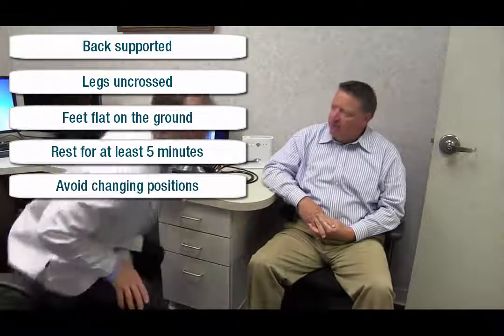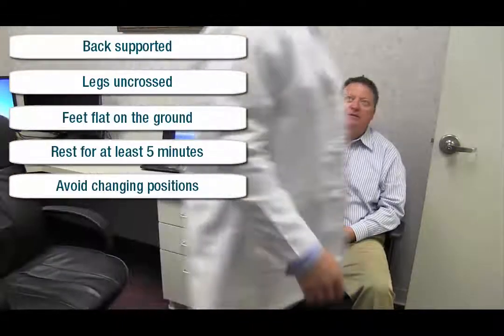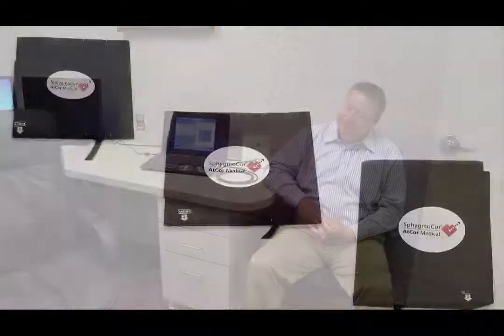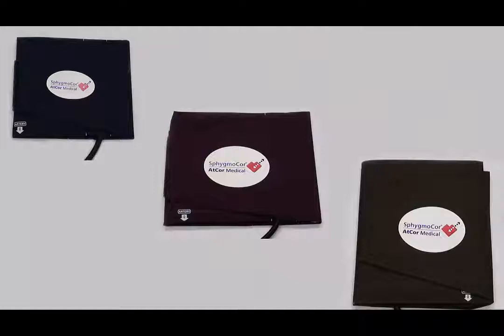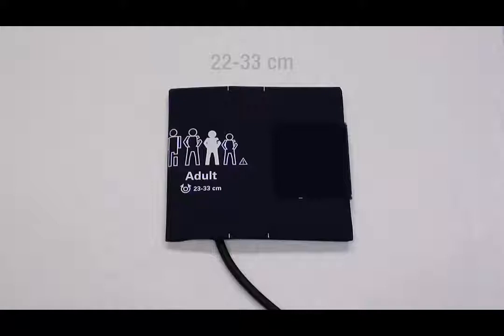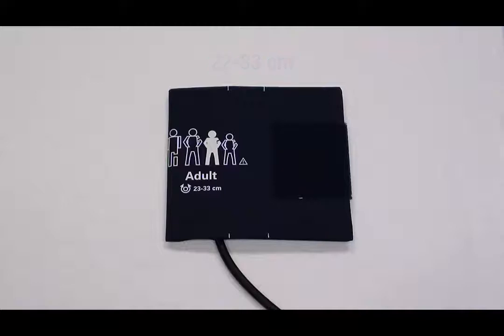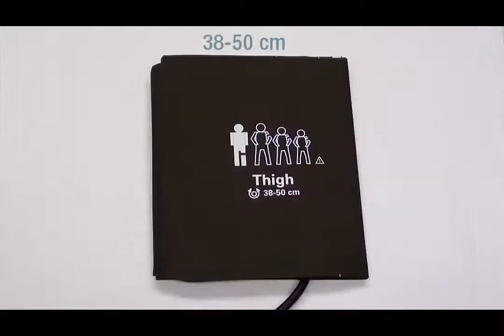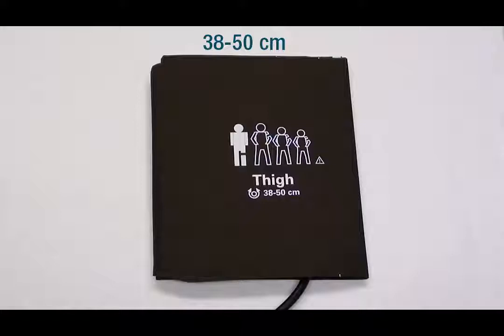If desired, the test may also be performed in the supine position. The SphigmaCore XL system comes with three different sized brachial blood pressure cuffs to be used when conducting a pulse wave analysis assessment: a dark blue cuff for patients with an arm circumference between 22 and 33 centimeters, a maroon cuff to be used on patients whose arm circumference is between 31 and 40 centimeters, and a brown cuff that fits arm circumferences of 38 to 50 centimeters.